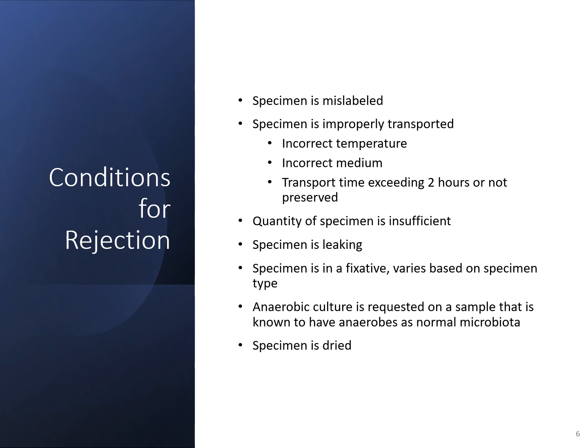It would also be rejected if it's not properly transported: if it was stored at the wrong temperature, collected with the wrong swab, or put in the wrong collection media. If it got lost in the courier's car overnight and has been sitting in the hot car for 24, 48 hours, then that specimen obviously couldn't be cultured, because those organisms would either have a lot of overgrowth, or depending on the temperature, they could have been destroyed or dried out. If there's not enough specimen to perform the culture, or if the specimen has leaked inside of the bag, it could have been contaminated. If it's in a fixative, which will vary by specimen type, some fixatives will destroy the bacteria.